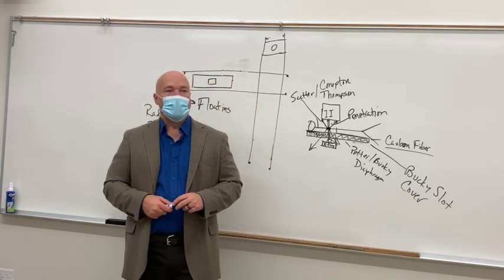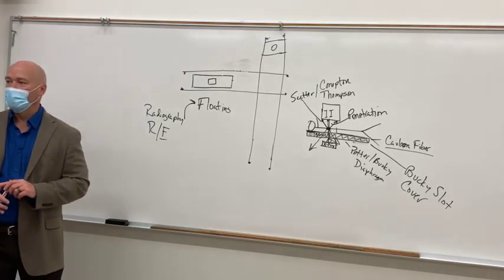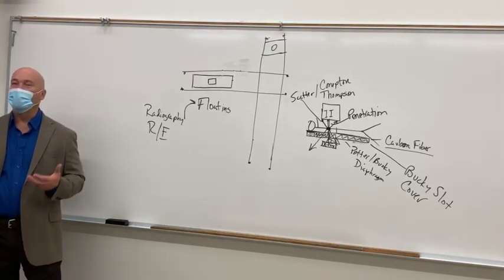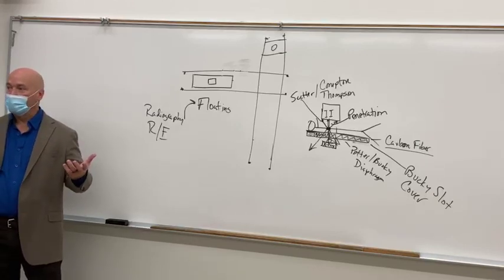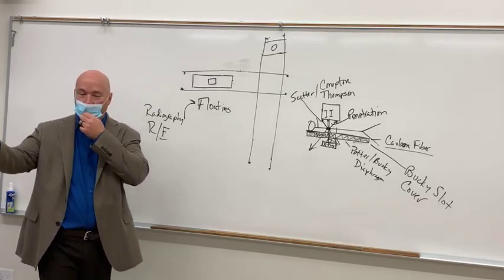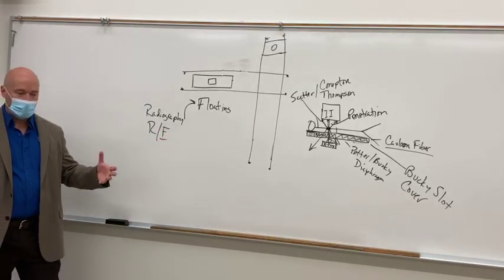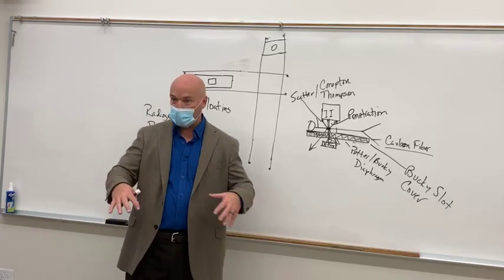All right? So has anybody done a barium swallow? Okay. How do you start with a patient in a barium swallow? Well, not a modified barium swallow, but more like an esophagram. They're standing up, right? Is that what you said? It sounded like sitting up. Scout first. Yeah, very good. Scout first, and then you start with them standing up. So you're in a fluoro room, and what you've got to do when you get prepared for these is make sure that you have a footboard on the table.